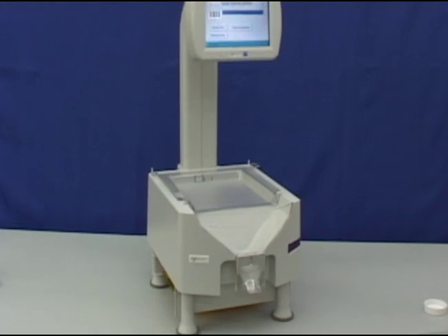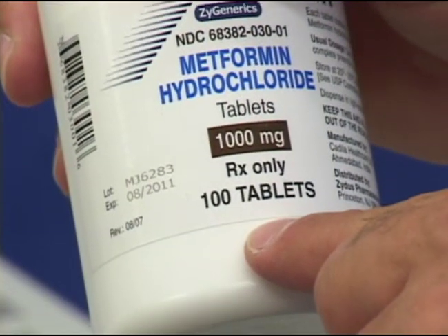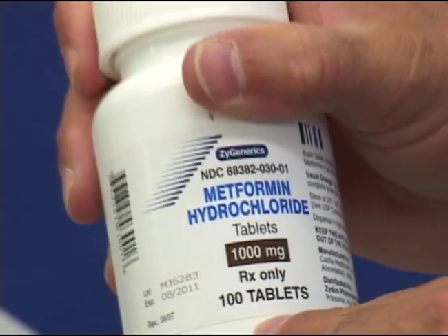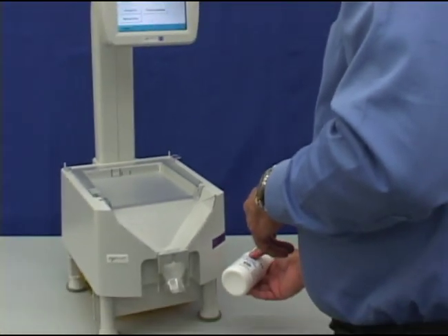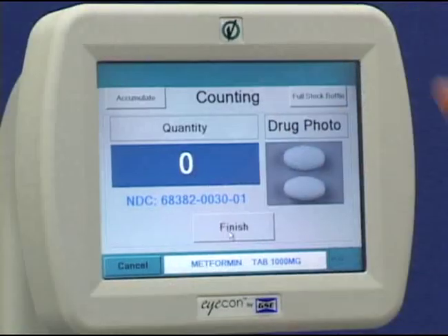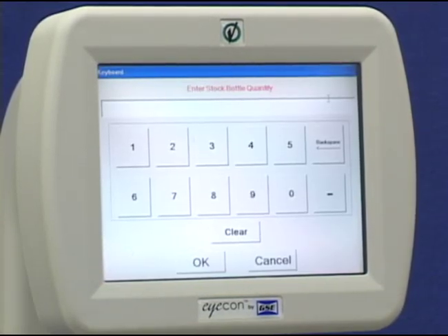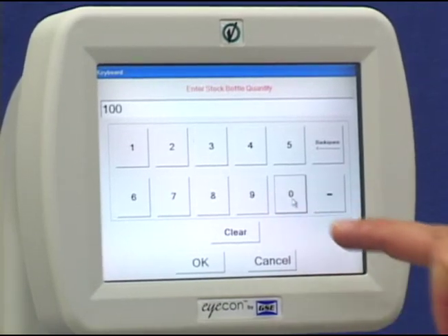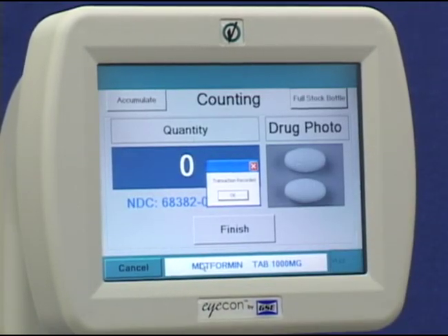Continue on to the next stock bottle. To inventory full stock bottles, scan the barcode. Press the full stock bottle button, key in the number of pills in the bottle, and press OK. That bottle is now inventoried.